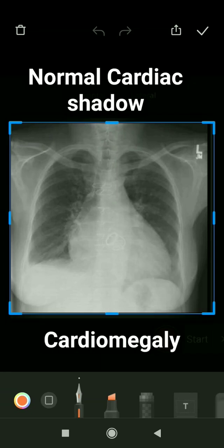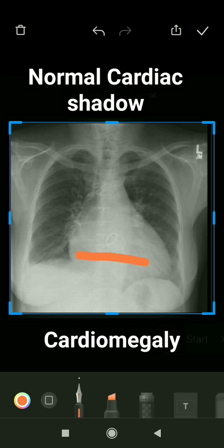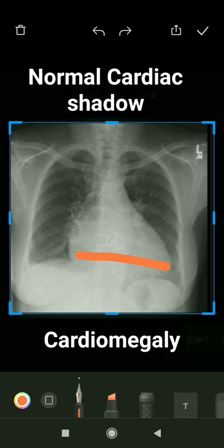In an X-ray, how do you know whether a given case has cardiomegaly or not? First, we have to measure the transcardiac diameter — the maximum diameter possible of the heart. Then you have to measure the transthoracic diameter. It should be a linear line; it can't be oblique.